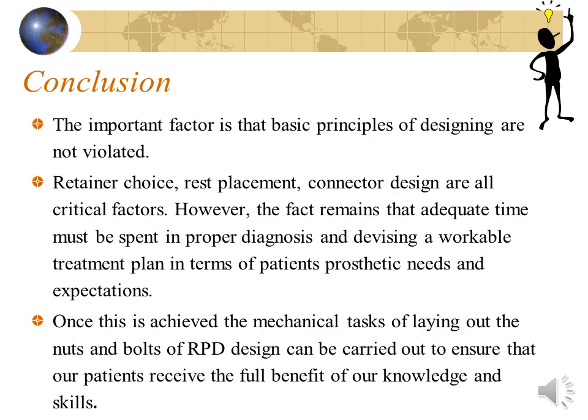So, to conclude, it is important while designing the RPD framework that the basic principles of designing are not violated. Choice of retainer, placement of rest, connector design, all are critical factors.